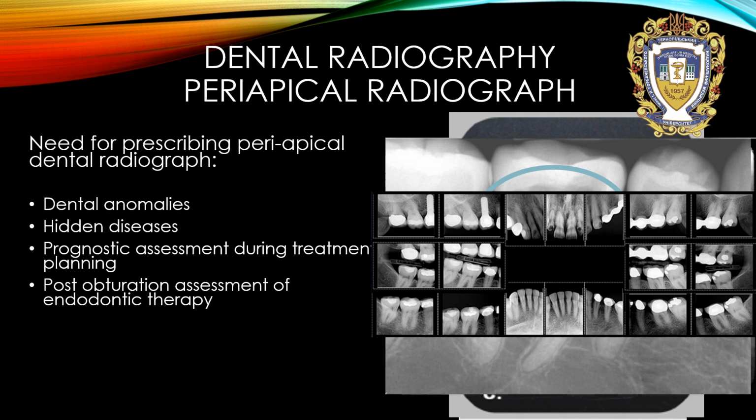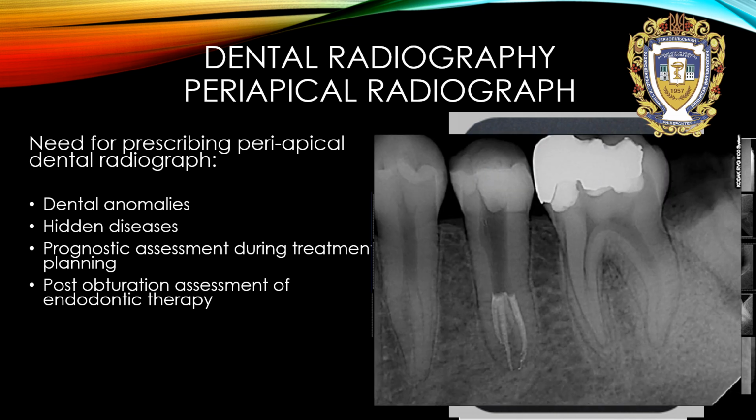Post-obturation assessment of endodontic therapy. Here they show a very interesting situation. Left lower second premolar with successfully filled 1, 2, 3, 4, 5, 6 root canals.